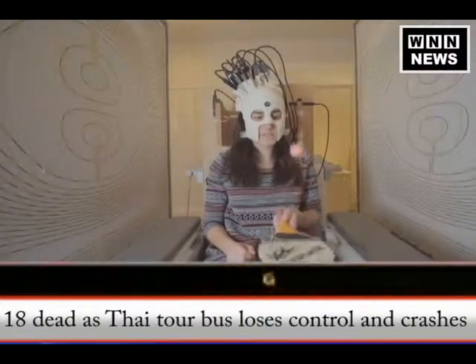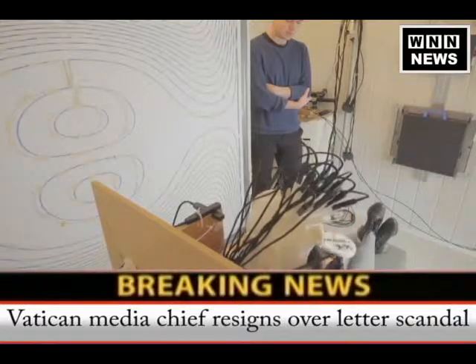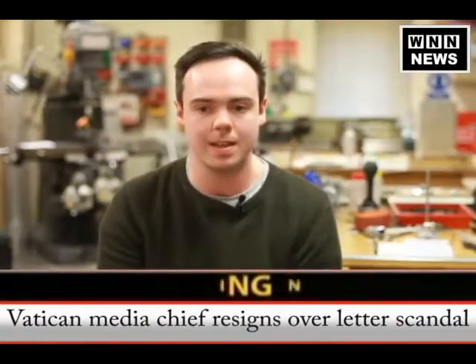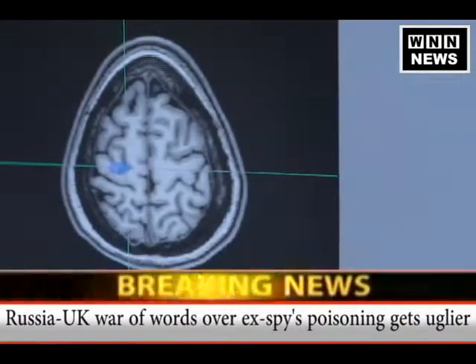They're housed on two planes either side of the subject, so you've got one going down here, one going down here. And that keeps the scanner quite open, you can walk in and out of it. Crucially, it meant that the sensors wouldn't fail if the subject moved even by a tiny amount. And that meant that any information we were getting from the sensors we knew was coming from the brain, and that we would be able to do these cool experiments.